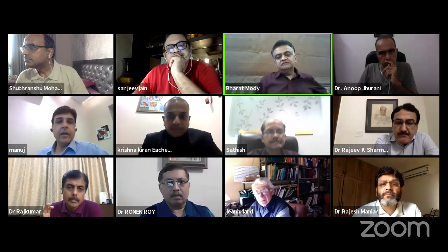Yeah, Rajesh and then Raj to continue. First, Rajesh. Krishna, did you mention that you avoid having to do the lateral retinacular release for the tracking because you've done the lateral epicondylar osteotomy? No, because that in no way is going to correct your patellar maltracking if it is going to happen. No, not at all. So I'm not saying that.